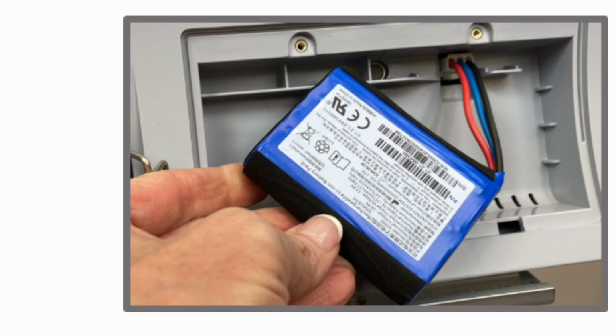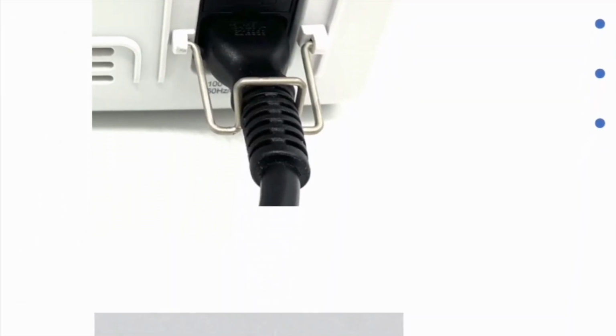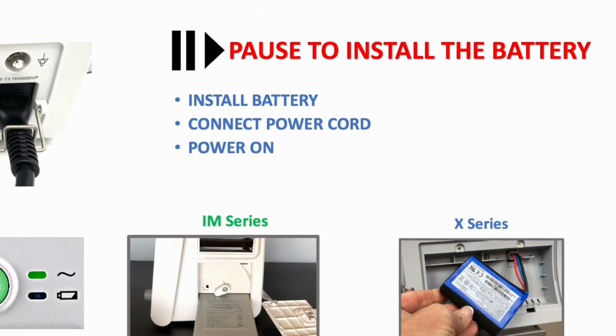Once the battery is installed, plug in the monitor to power and press the round button on the bottom left to turn on the monitor. Pause to install the battery now.